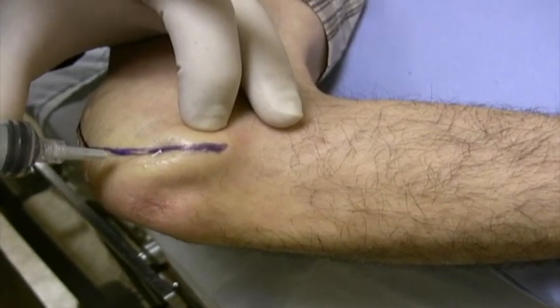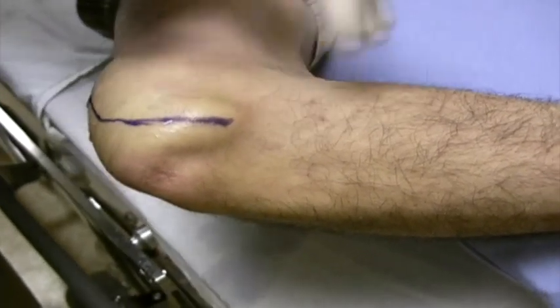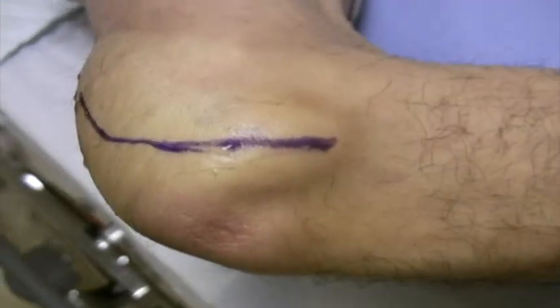So that's the end of it. That's 40 cc's of 0.5%, and I'd be happy to put in more if we needed to, but I think that's probably going to be it.